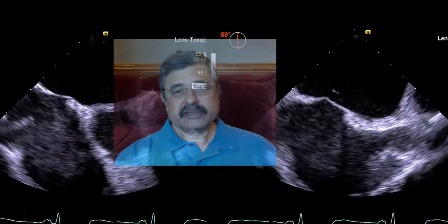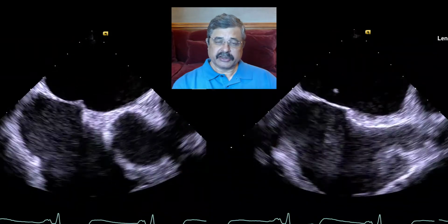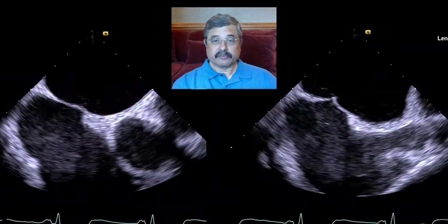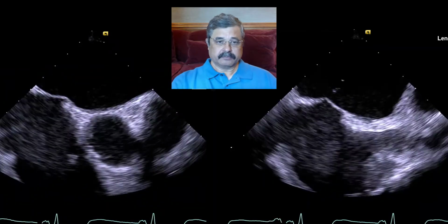However, as you can see, the maintenance of this location of indentation led to a septal puncture which was more anterior than we liked it to be, which led us to revise the transseptal puncture, as you can see in the subsequent video.